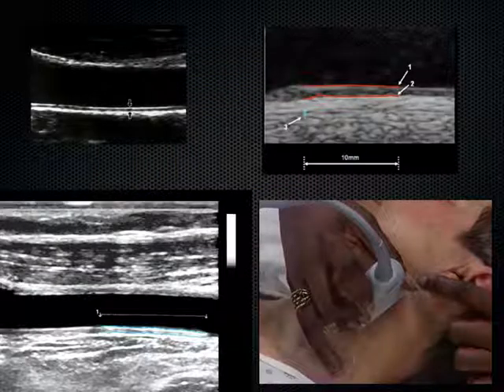Because it turns out that when sound goes through blood, blood is a low attenuating structure. Think back to the physics talk: low attenuation, sound loves to travel through fluid. That's why we use the lumen of the carotid as a window to better visualize structures posterior to it, specifically the posterior wall of the medial intimal layer of the carotid artery. That's why we measure on the far wall down here and not the near wall up here, because we use the carotid blood as a nice echogenic window because it's low attenuating, and that's why everything back here looks so darn hyperechoic.